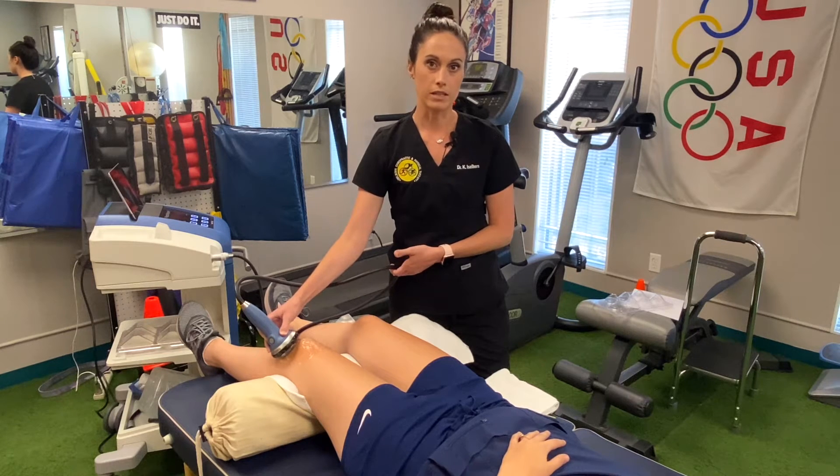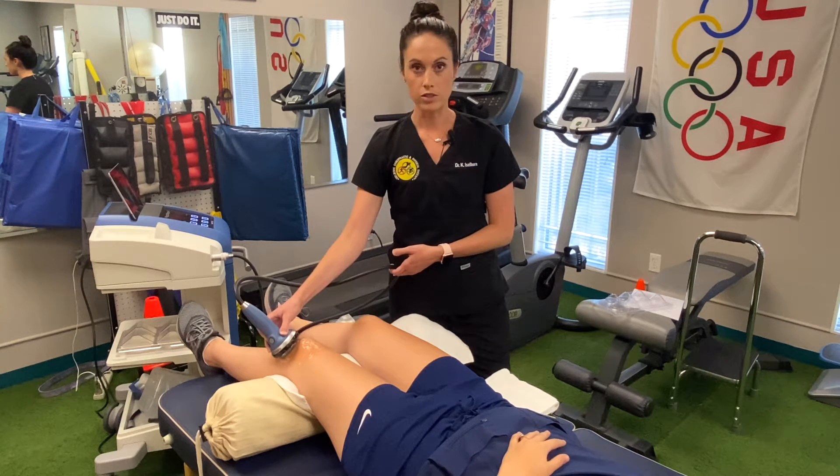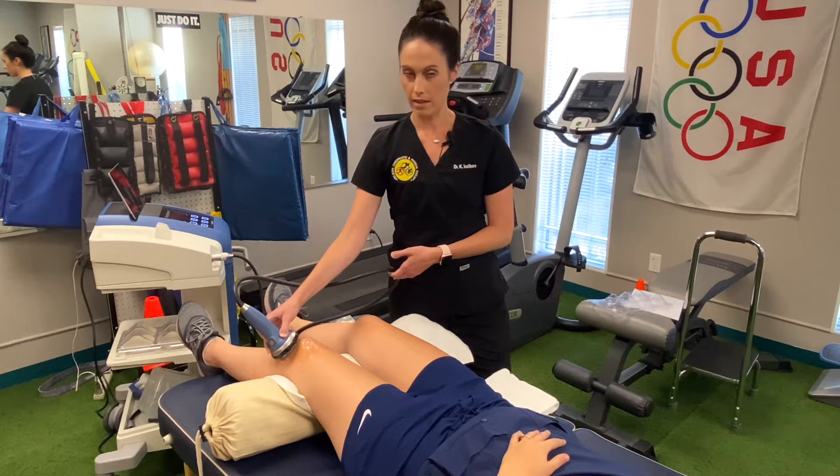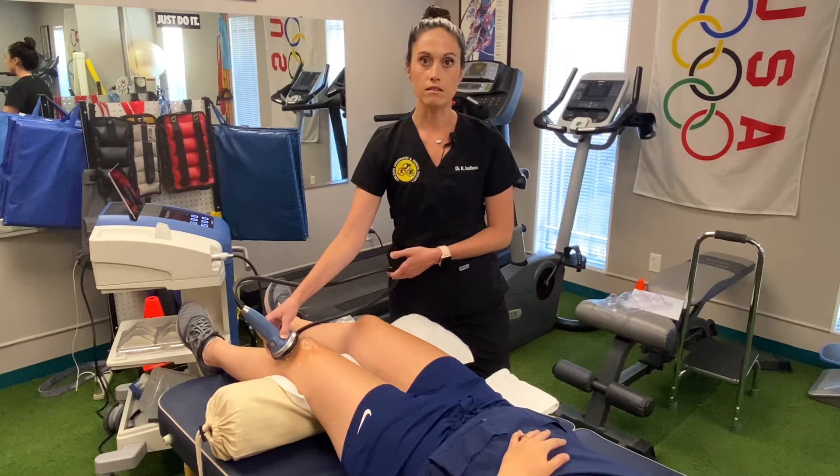PisaWave is essentially shockwave therapy. It's sending shocks into the joint, the tendon, the muscle, breaking up any scar tissue, adhesions, things like that — any sort of pathological traits in the soft tissue structures.